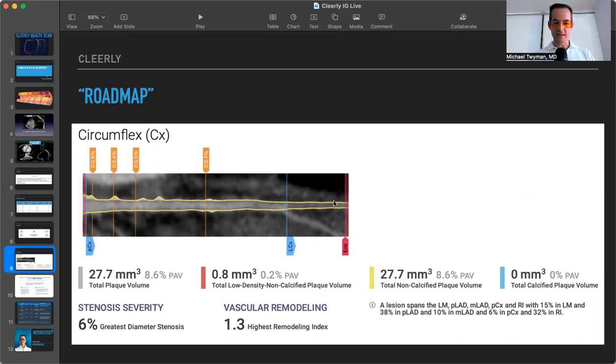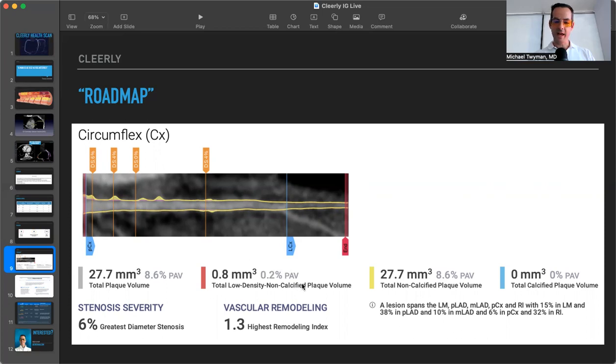And maybe it's right about there or so where, I'm sorry, maybe it's actually down low, where the low-density non-calcified plaque is. So a very low percentage of this plaque is down here and is the more potentially vulnerable plaques.